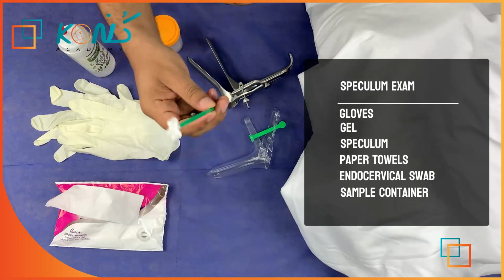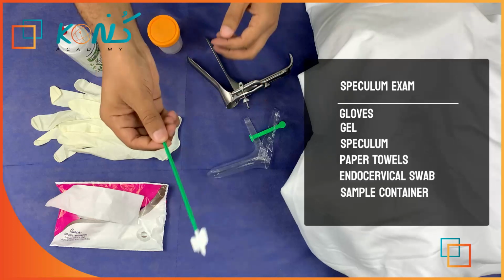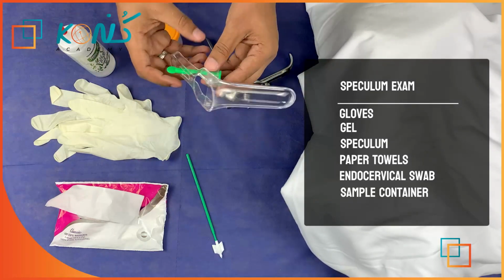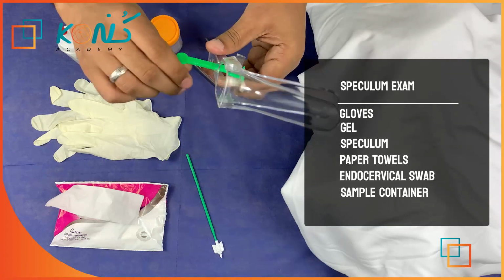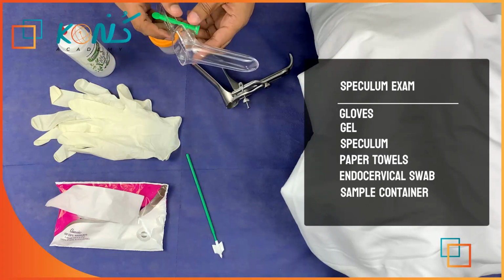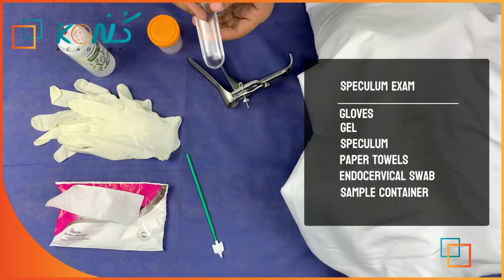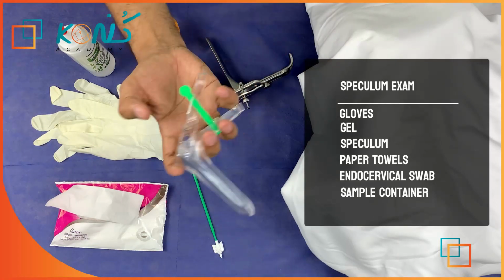I hope the point of this endocervical brush is crystal clear for you, and both speculums like this. The most important thing about the speculum is this screw of the speculum that we are locking the speculum with, and second, how to hold the speculum. Ideally, try to hold this speculum this way, like this.